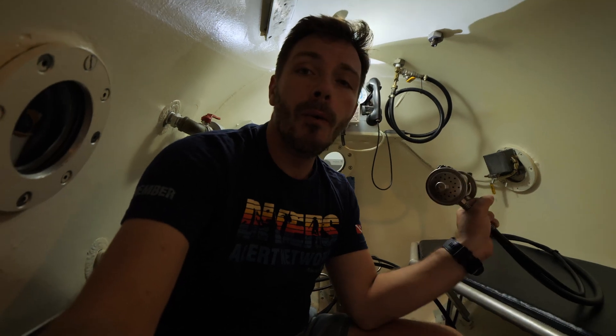Behind me is the patient bank with the BIBS system. This is where the oxygen comes from and is also evacuated from the chamber when people are breathing. The patient will be lying down here for three to sometimes six, seven, or eight hours depending on the treatment table, severity of injury, and the doctor's orders. Luckily, there is a small entertainment system — a projector outside the window projects onto a sheet inside that acts as a cinema screen, so you can watch something to distract your mind during those long hours.